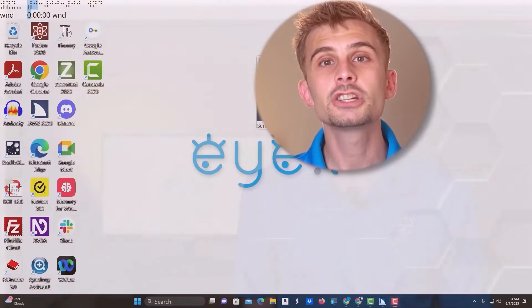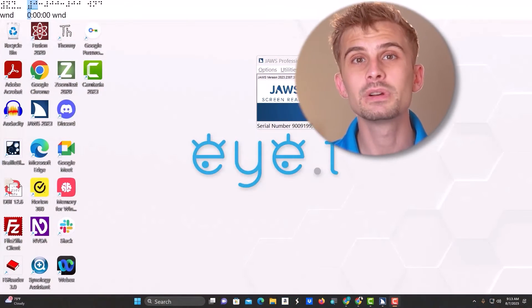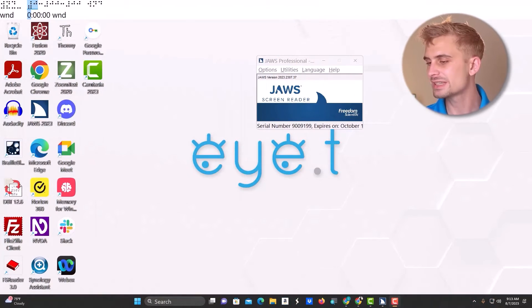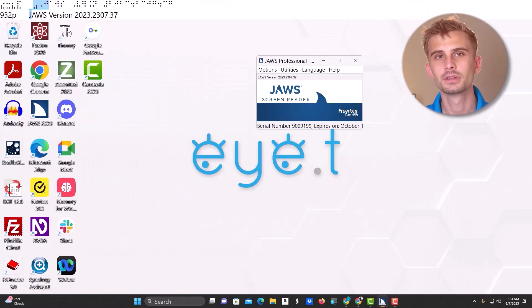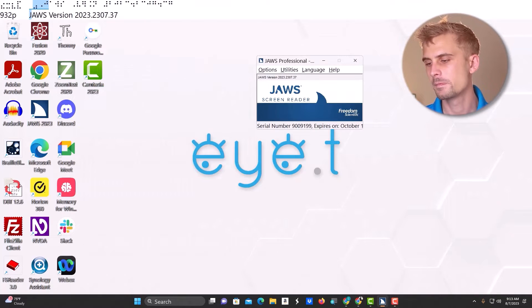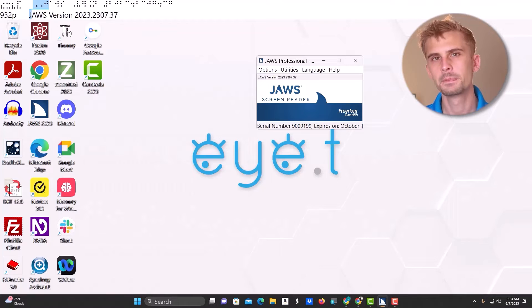I'm going to be using the key commands for this process, but if you're a sighted instructor setting this up for a learner, you can always use your mouse. So first, I'll make sure my program focus is focused on JAWS. That's Alt plus Tab.